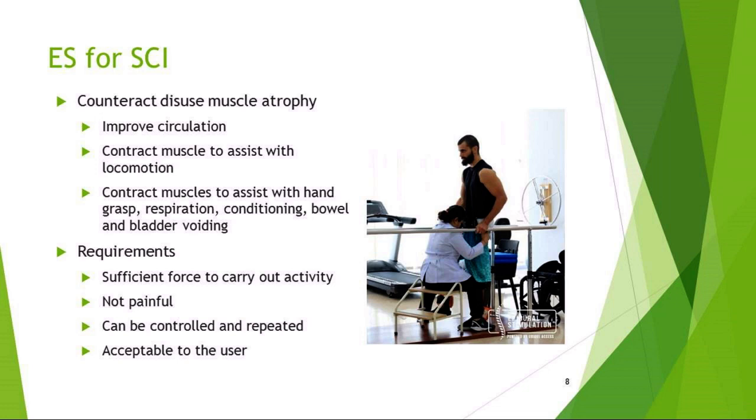Usually you have to be able to stim them with sufficient force to carry out the activity, and it can't be painful. The good thing about it is it can be controlled and repeated, and it's usually an acceptable activity for the end user. So if you get a chance to get hooked up to an electrical stim bike, do it, because it's nice to know how it feels. It's not comfortable, and it's not easy.